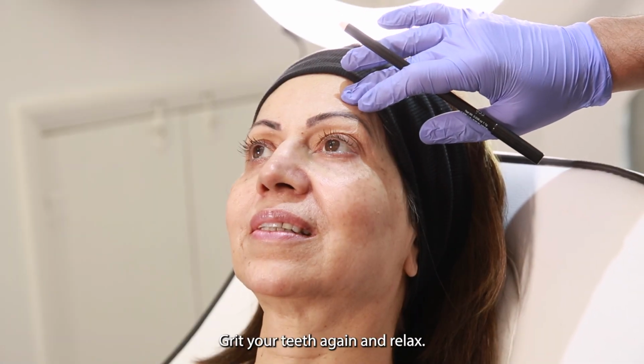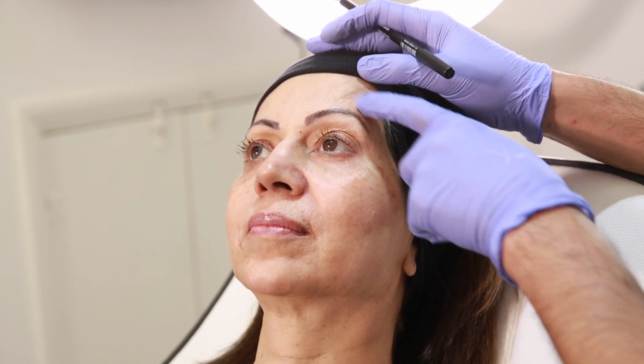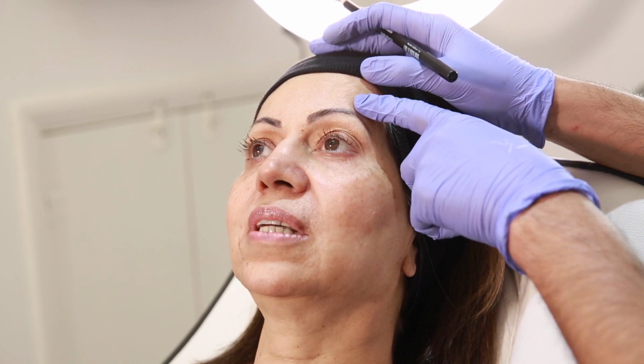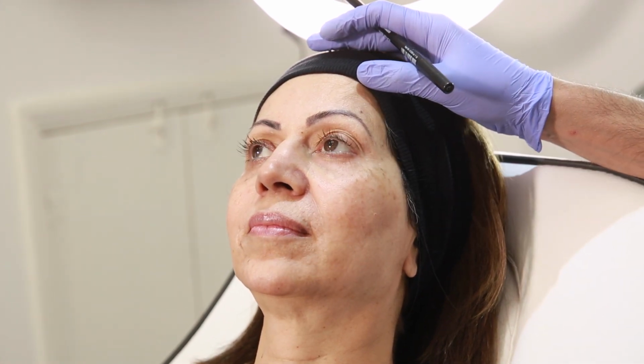Just grit your teeth again and relax. When you say grit your teeth, do you mean the back ones, yeah? Yeah, that's fine. You ready?